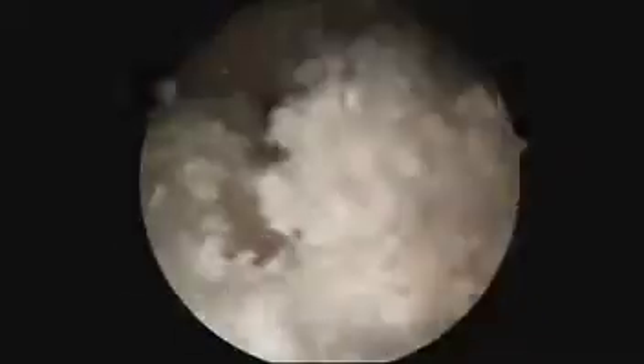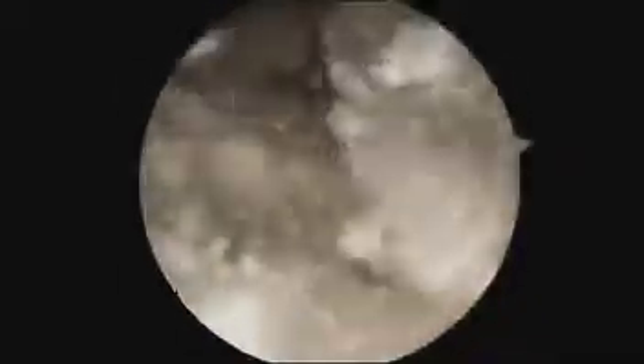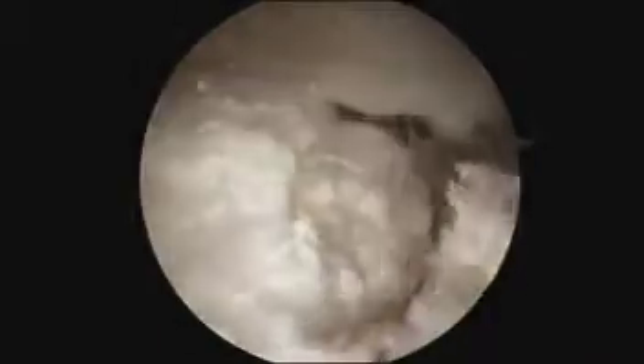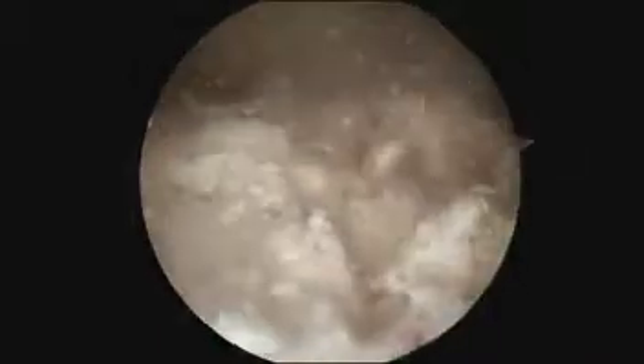The intratendinous deposition within the tricep tendon can then be debrided with an arthroscopic shaver and arthroscopic punch forceps. It is important to avoid excessive debridement of the tricep tendon in order to avoid tendon rupture.